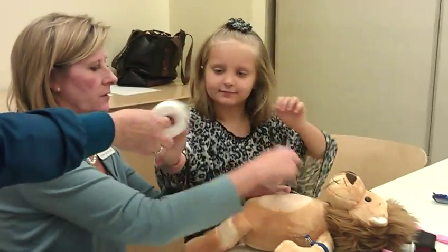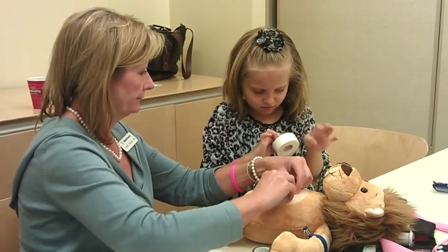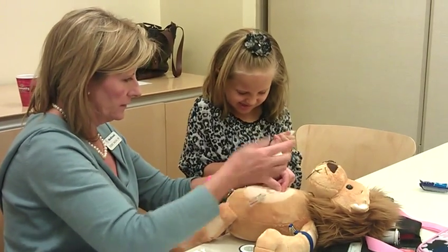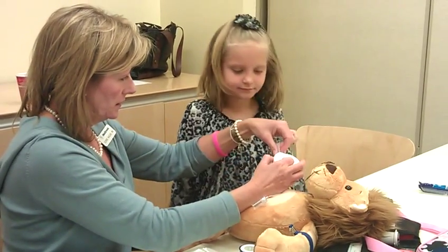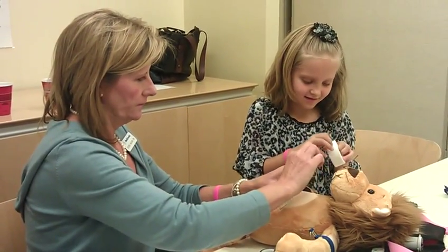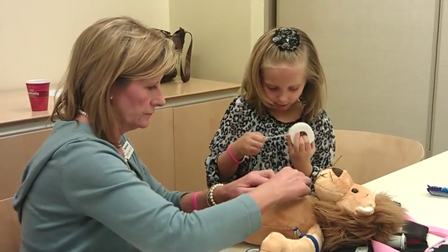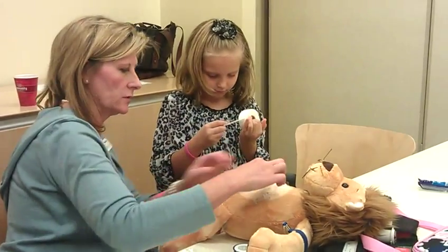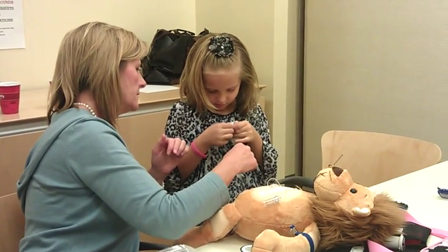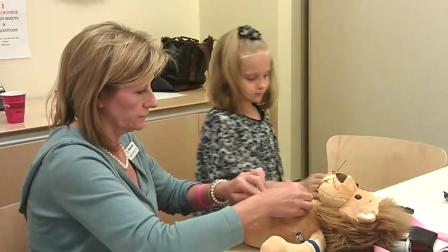So I'll wrap this up and you tear you some tape off. Lenny will be ready for his pump. There's so much hair — that Lenny, he's losing hair. Need some help there? It's perforated. Oh, is it? Oh, very cool. Where'd you get that? Let's use two pieces. I think I found it at CVS as well. Cool beans. I like it because it's just the right size for everything we use. One more piece — get two pieces so it'll go across. It's perfect right there. And what I'll do is I'll just cut the tube off and then stick that into the clay and just let it.